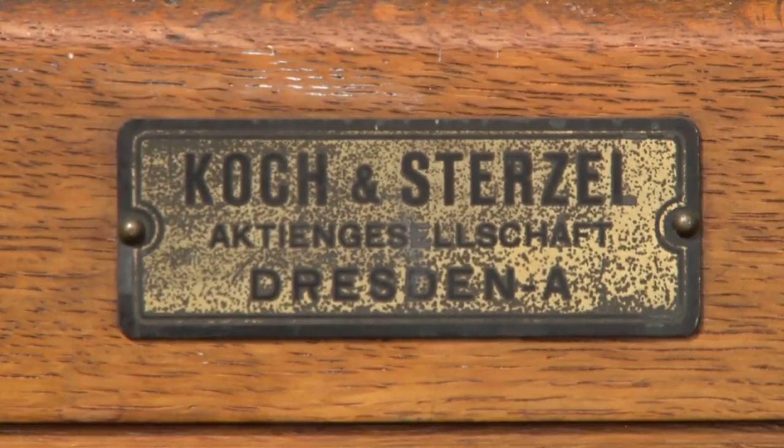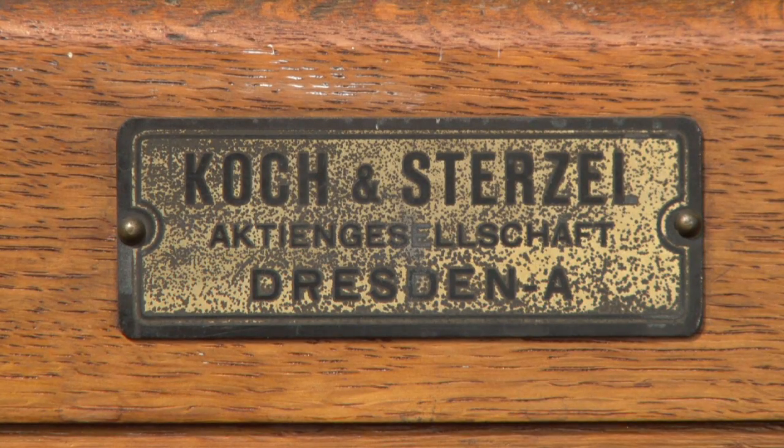Today I wanted to tell you about one of my favorite objects in the museum, the wooden x-ray machine. This machine was manufactured in Dresden, Germany around 1929.